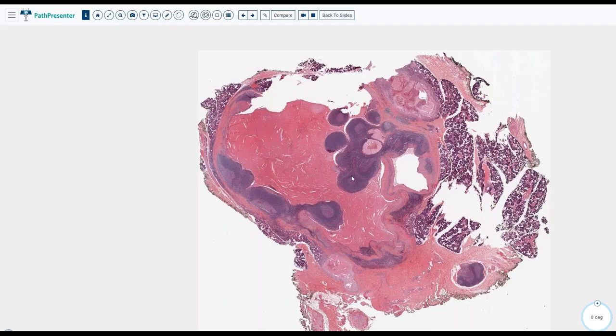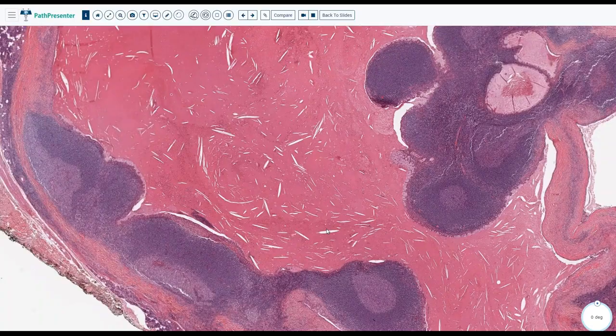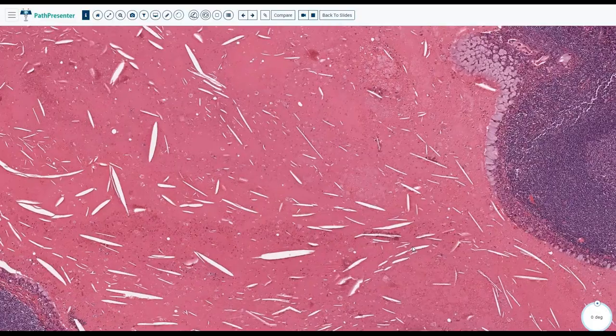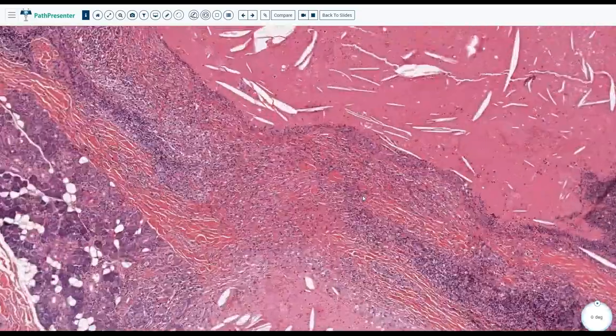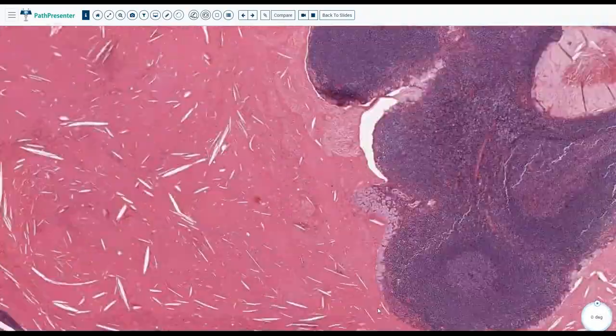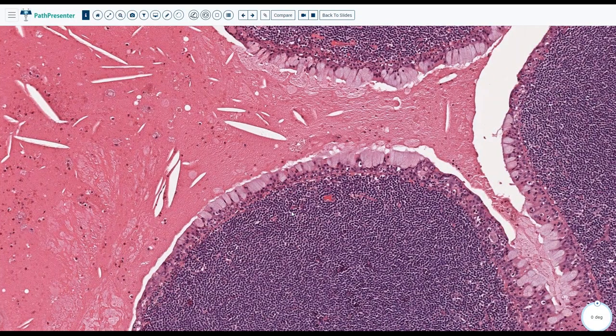Okay, so you'll see a papillary cystadenoma lymphomatosum. That is the other name, okay? So again, in the papillary cyst, we see a lot of these cholesterol clefts. Anybody know what these are? So these probably follow fine needle aspiration, and there will be areas of fibrosis, and hemosiderin macrophages. But we see here some lining. Do you know what kind of lining usually we have? What are the changes in the lining here?